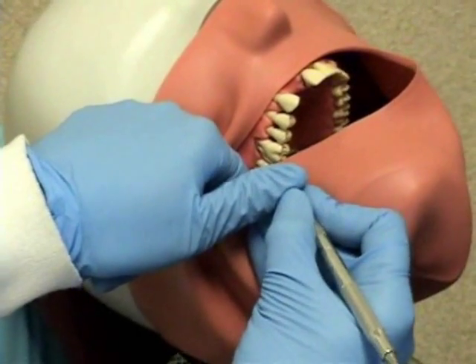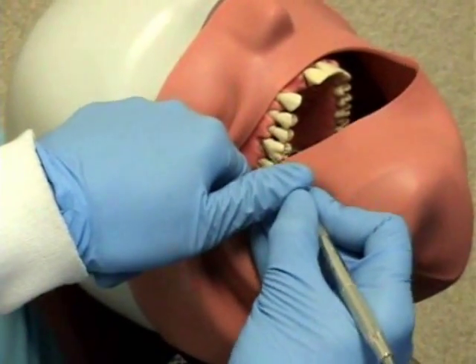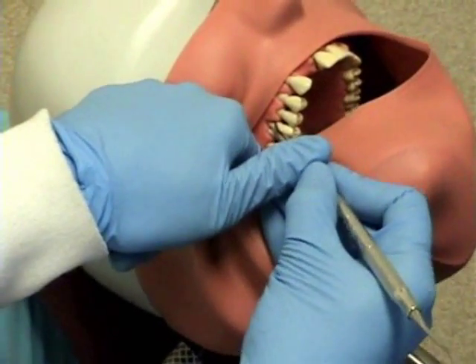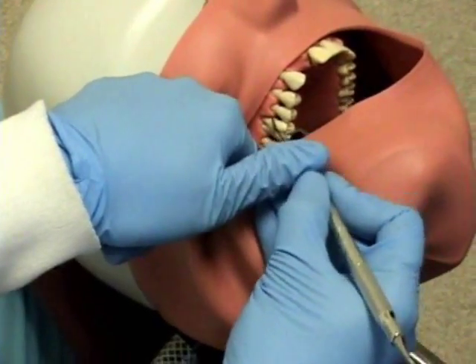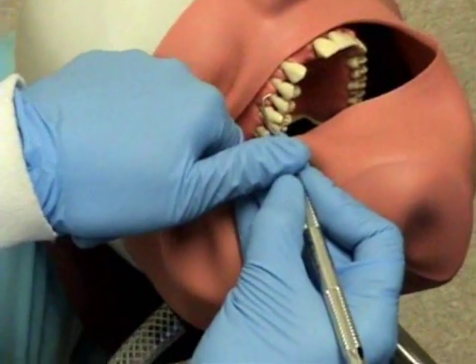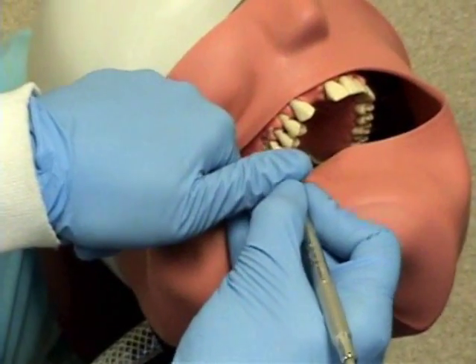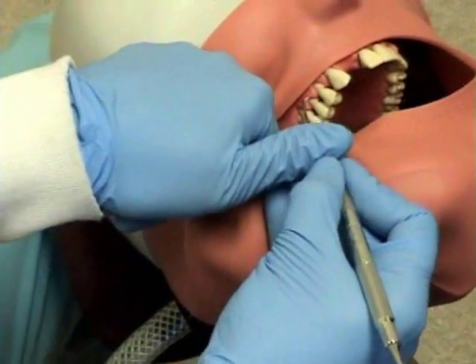Ms. Johnson is using her non-dominant hand, the index finger, to retract the lip and the cheek. The thumb of the non-dominant hand is supplying reinforcement and added lateral pressure to the instrument. This is also an advanced instrumentation technique.